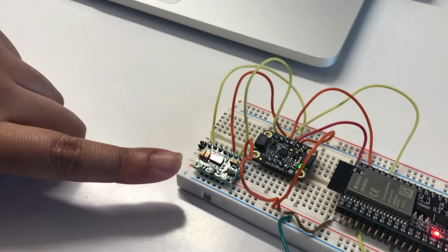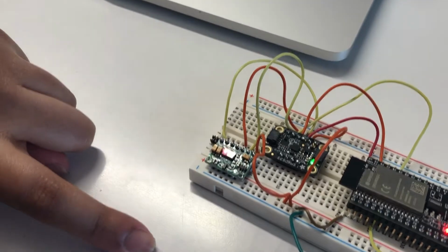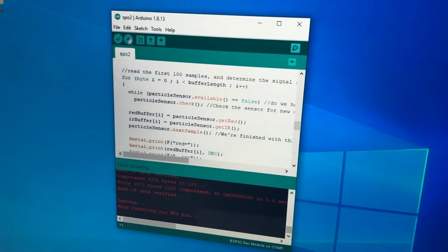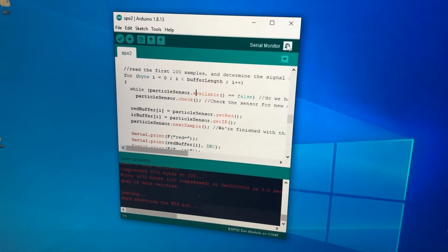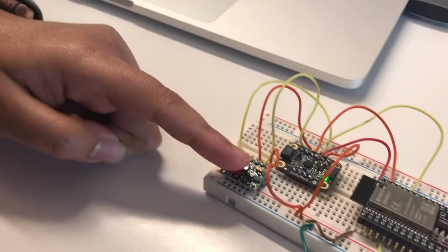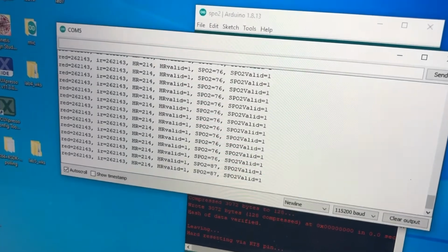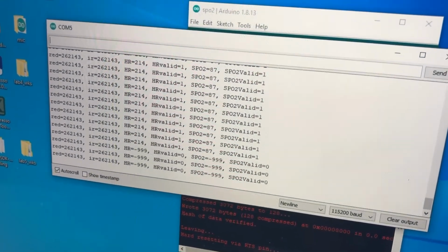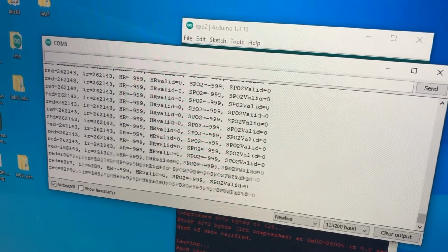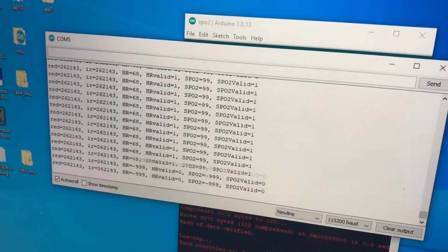Okay, so next we have our pulse ox and heart rate monitor, which is the green sensor right here. The red light is on, so it's getting power. Again, we're using Arduino IDE. The code has already been loaded, and this time we're going to use the serial monitor to observe our readings. And so I will place my finger on the sensor, and we can observe my heart rate as well as my oxygen saturation. There are valid bits, so if it gets an invalid response, it just means that my finger is not placed correctly, and so I can readjust and it will give me the right values.